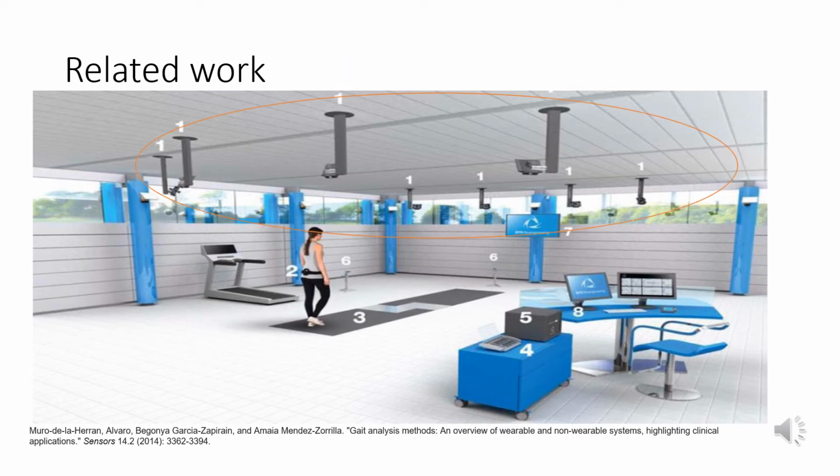The traditional gait laboratory is a gold standard in monitoring gait parameters, but it's occupied exclusively for one participant at a time, and the cost is very high.